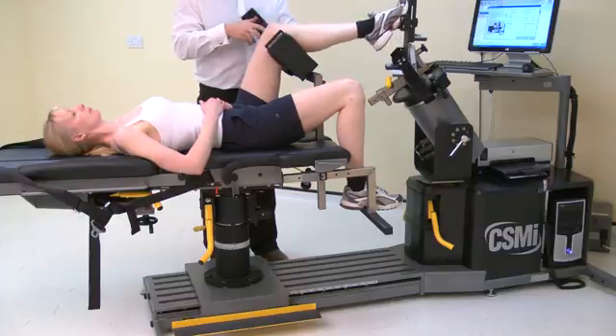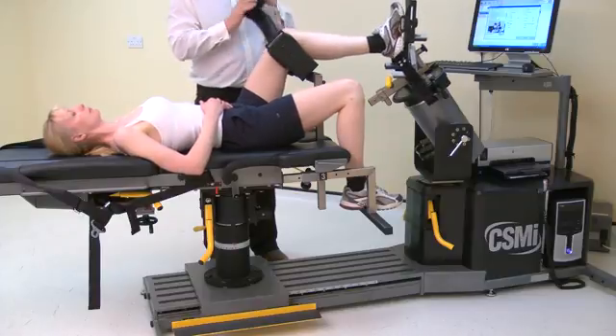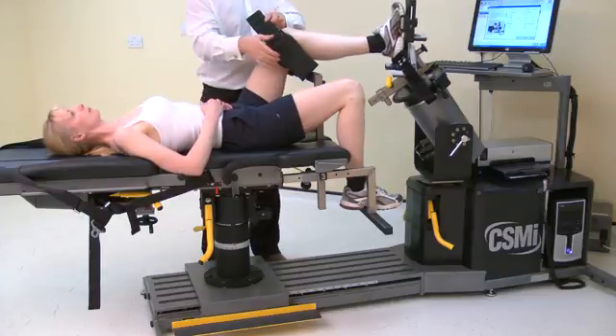Secure the thigh with the strap. Note well: this strap should not be over tightened.